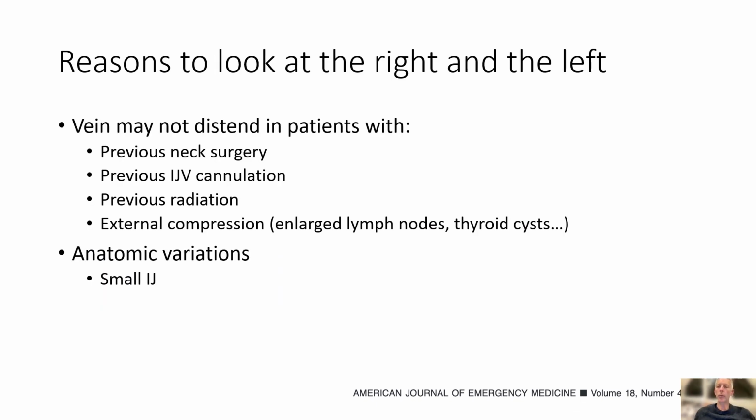We should use whichever side of the neck is going to give us the best information. Out of habit, I generally start with the right side of the neck, although there is nothing to say that the left is less accurate. There may be a clear reason to start with one side of the neck, as listed here. However, if you encounter something unusual about the image on one side of the neck that may impact your interpretation, it is a good habit to take a look at the other side as well.